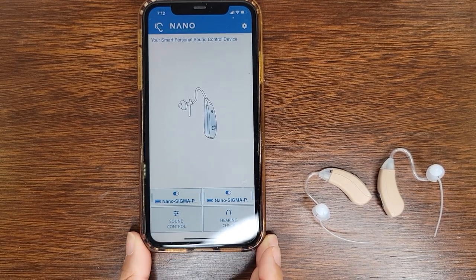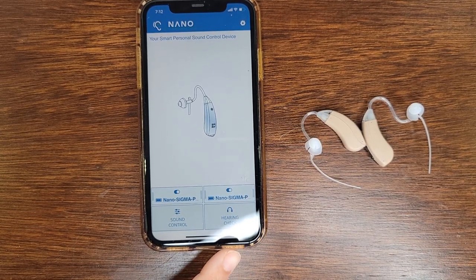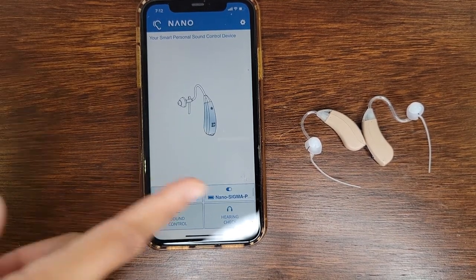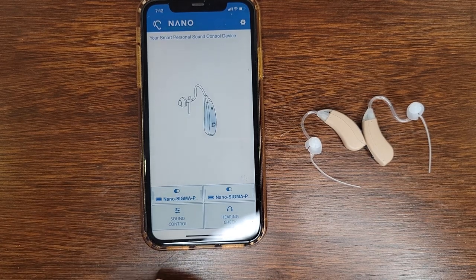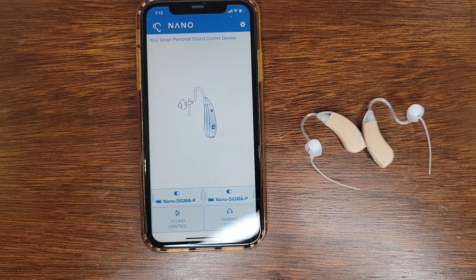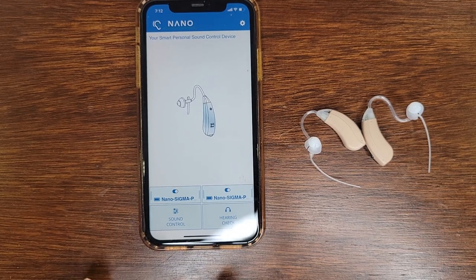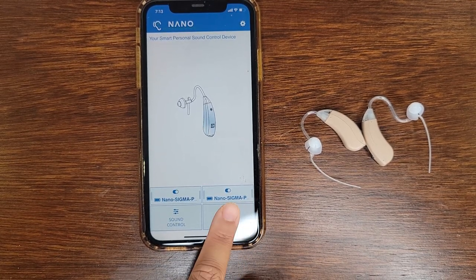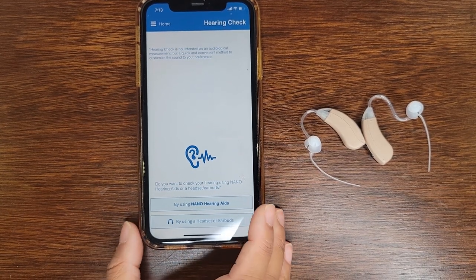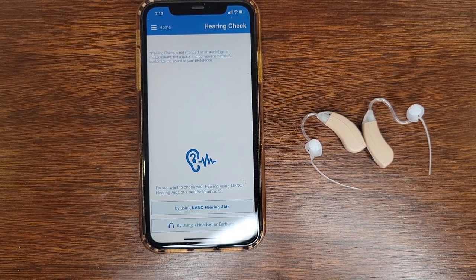This is our homepage for our app, and we have a settings button right here, and it's showing the battery percentage for the right and left ear. And then we also have a sound control tab and a hearing check tab. So before you get started, you would ideally do the hearing check. So let's do our hearing exam to see how much help we need, and it will adjust accordingly to your test.